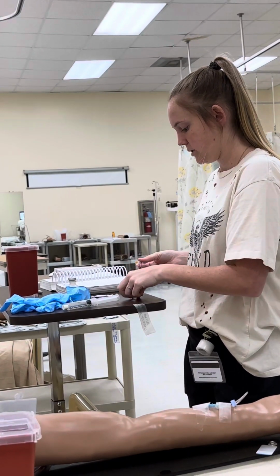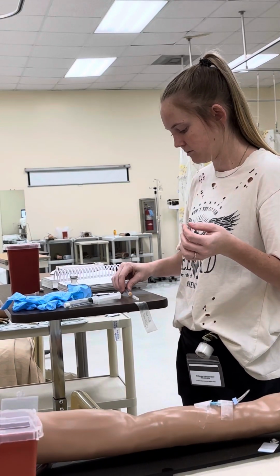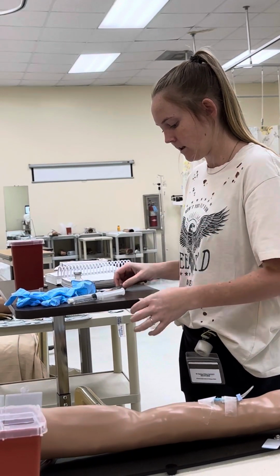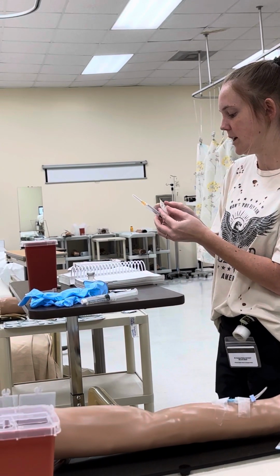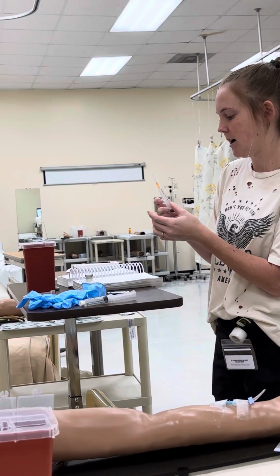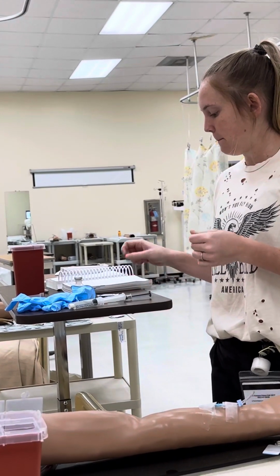And I'm then going to cap the medication. And I'll then label my syringe with furosemide 40 milligrams in 4 milliliters, and I'll also initial and put the date and time that I drew up the medication. I'm then going to go to the patient's room.